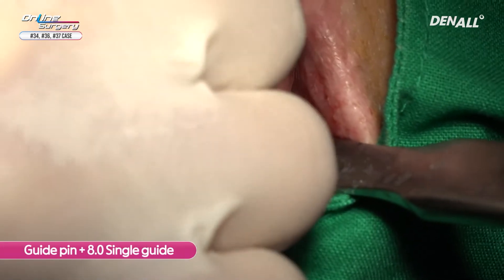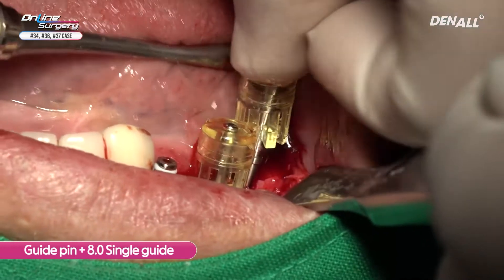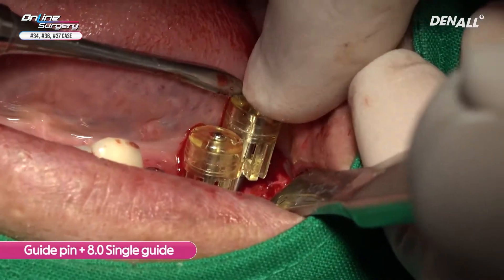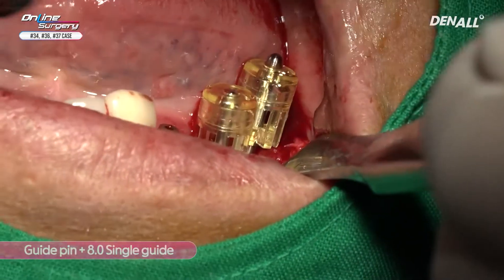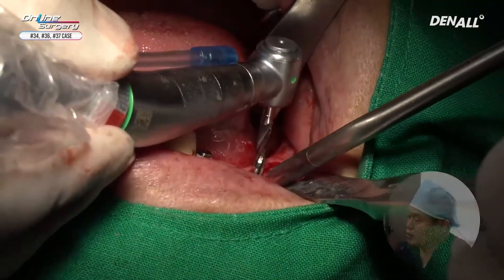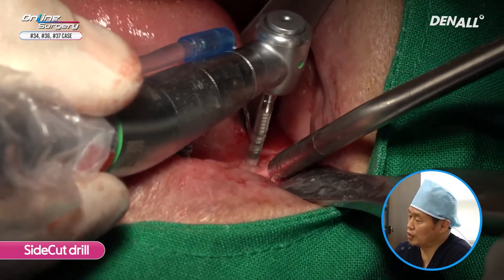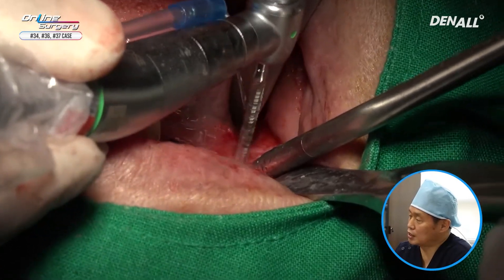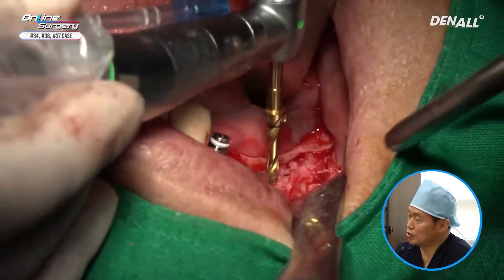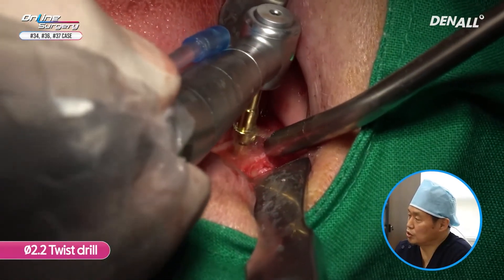The posterior position is going to be prepared. The distal one is slightly closer towards the front. Because of the antagonist relation, a side cutting drill is going to be used to expand distally. Distal expansion has been done. Compared to the original plan, it's placed slightly more distally.